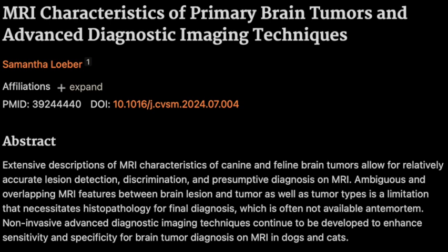It's like, imagine a blob of dough spreading out on a baking sheet. Okay. Yeah, it's not so neat and tidy. Exactly. So sharper borders, probably a meningioma. Okay. Fuzzier, maybe a glioma. Got it. And then we also look at what we call signal intensity.